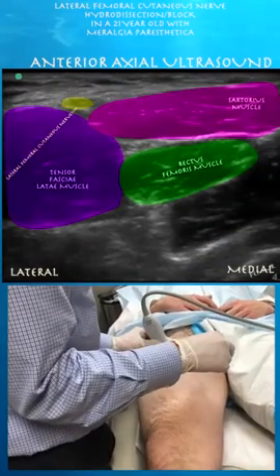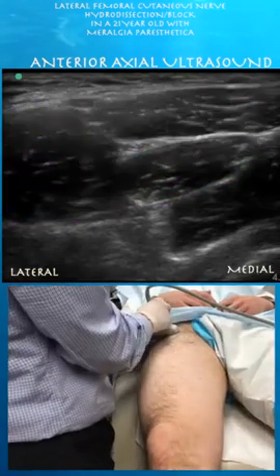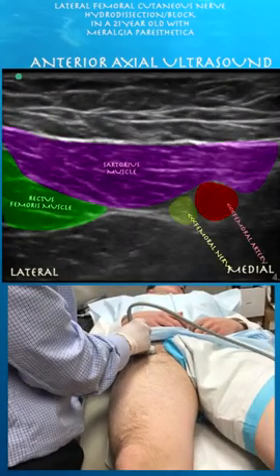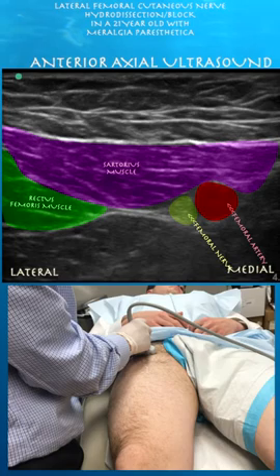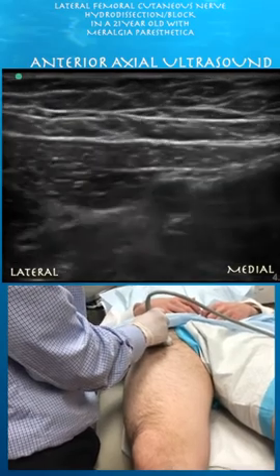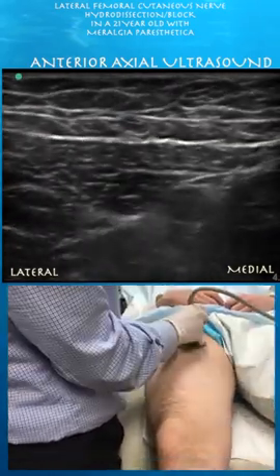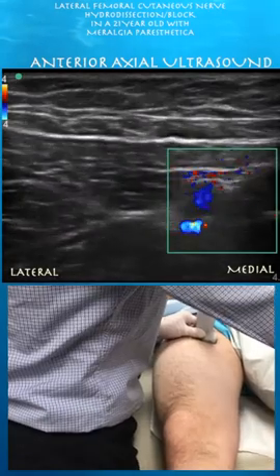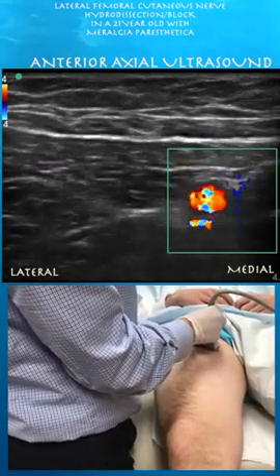Right now we're over the rectus femoris muscle. You can appreciate some of the muscle layers. You can follow the sartorius muscle that goes over the vasculature. So we've got sartorius now in the middle of the screen. If you're not sure which is sartorius muscle, the easiest thing to do is to find the femoral artery and femoral vein, and then you know that muscle lies right on top of that. You can see how it goes medial and then over the vasculature — kind of like a shield of the femoral vein and artery. Here the femoral artery is nicely visible and the sartorius muscle is essentially right above that.